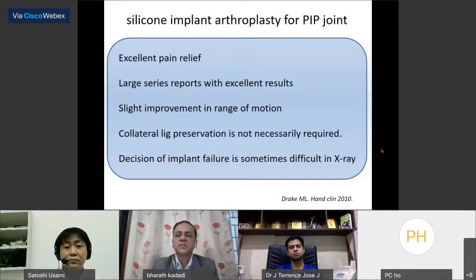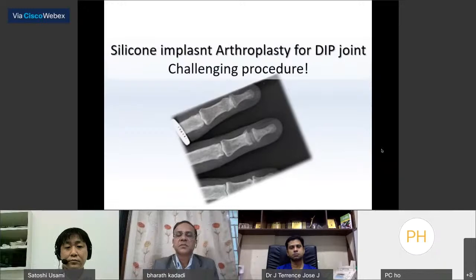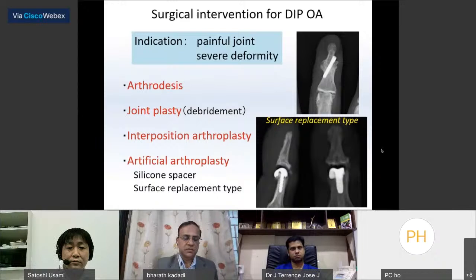Next, I move on to the arthroplasty for DIP joint osteoarthritis. I think it is a challenging procedure. Indication of surgical intervention for DIP osteoarthritis is considered for a painful joint or a severe deformity. Generally, arthrodesis is applied for painful DIP osteoarthritis, but some patients are reluctant to undergo arthrodesis. Recently, several joint movement preserving procedures have been reported, and I'd like to present the DIP arthroplasty with use of a silicone spacer from now.